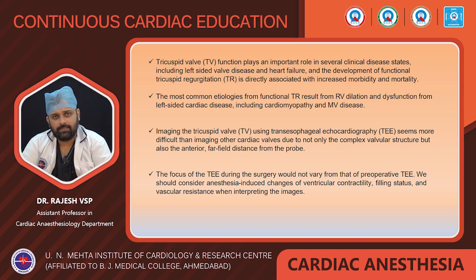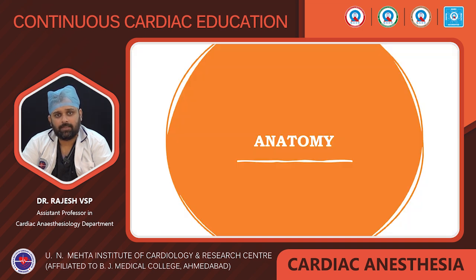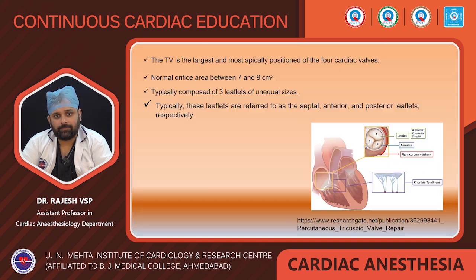The focus of the TEE during surgery would not vary from preoperative TEE, but we have to consider anesthesia-induced changes of ventricular contractility, preload, and vascular resistance when interpreting these images. First, we have to know the anatomy.